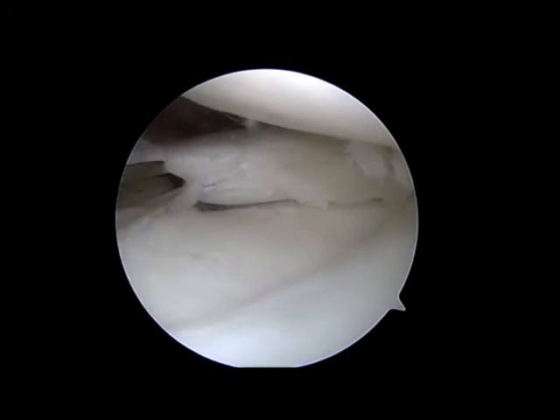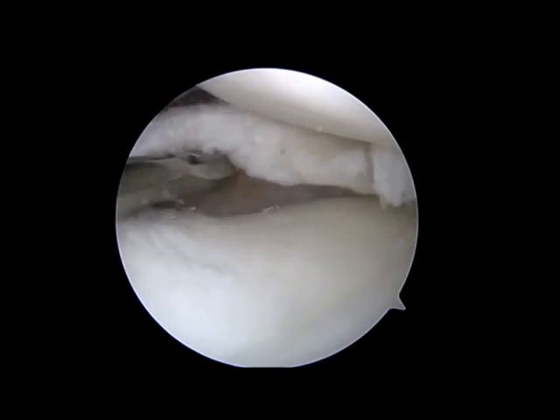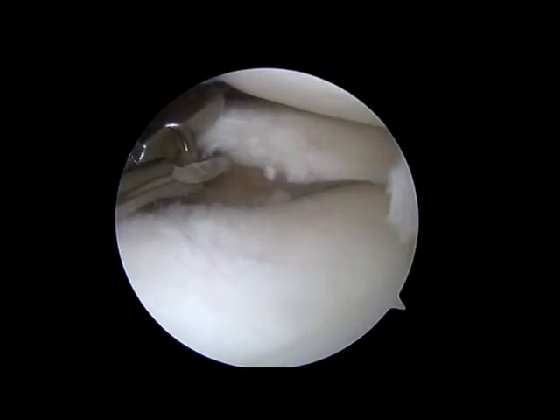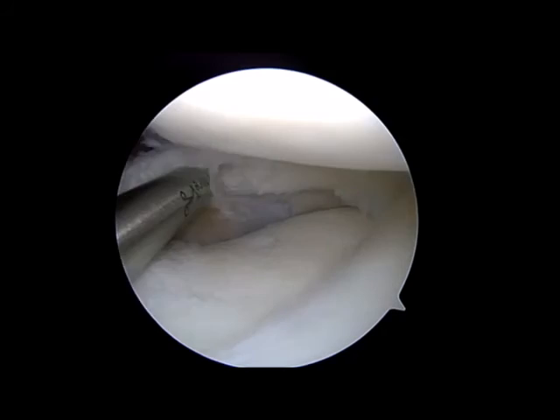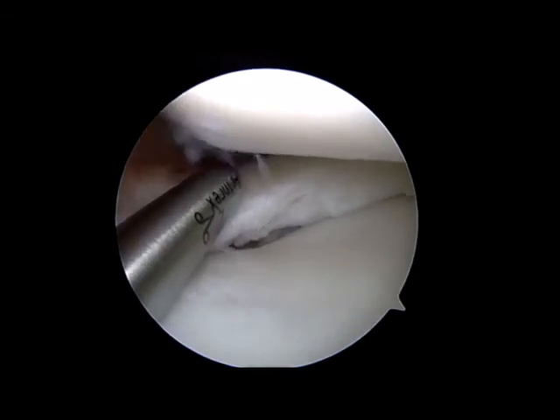I make every attempt to only trim torn tissue. The remaining edges of the tear are contoured. This is done to prevent acute edges from catching on the cartilage surface above and below. Once again, you can see that this tear has multiple planes, including a cleavage component. Once again, I bring in my shaver, smooth the remaining meniscus, and abrade the central cleft. This is being done to stimulate some healing.